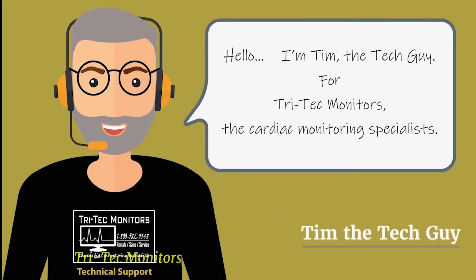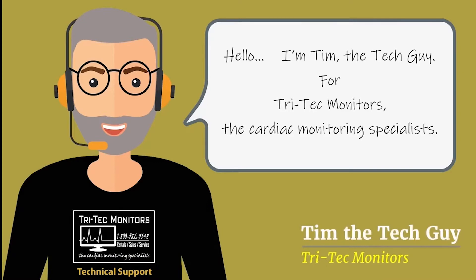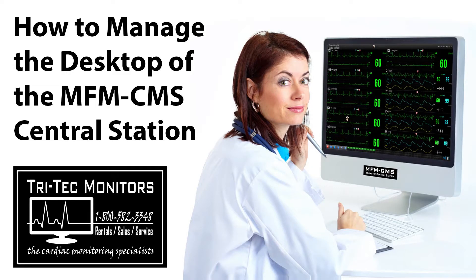Hello. I'm Tim the Tech Guy for Tri-Tech Monitors, the cardiac monitoring specialists. Today we are going to learn how to manage the MFM-CMS telemetry systems desktop.